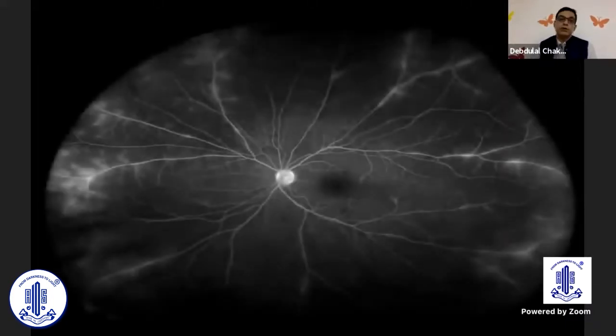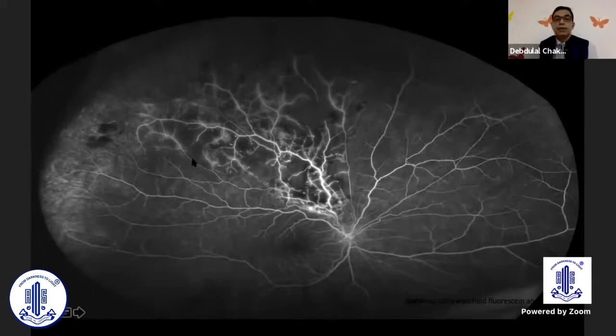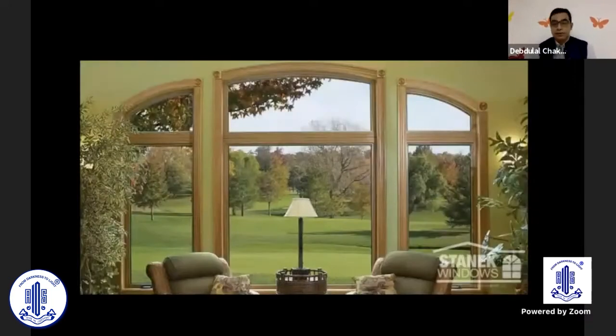Of course, Dogra sir will be speaking on uveitis, and of course, you can image vasculitis with the Optos. And going back to the retina, this is a BRVO, and you can actually see how much ischemia is there, and whether to do laser or not, or whether to let it go, you can decide with these Optos images. So everybody likes to have a good view, but this view is definitely better than the one previously shown. So it's the same for the retina.